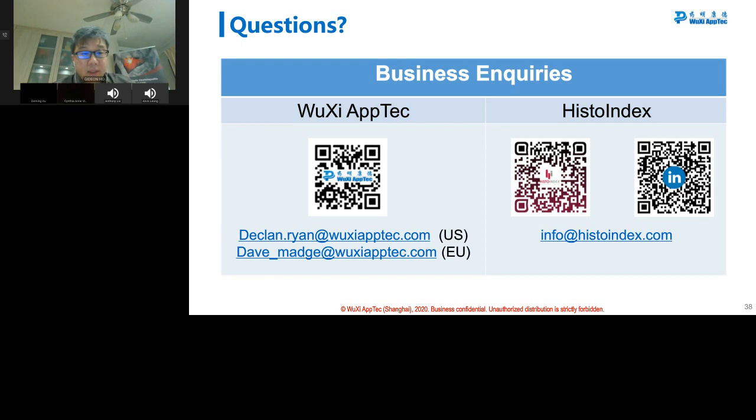Okay, so let me see. I think there's a pretty good question from Bahasini, Ridgeline Therapeutic. How are steatosis and fibrosis continuously monitored using Genesis? Is this via in vivo scanning? It's not in vivo. It is ex vivo, so it is still histology based. When we talk about continuous, it is a continuous way of measuring both fibrosis and steatosis, as compared to the pathologist's way of discretely categorizing them by severity. Normally in fibrosis, pathologists use F0 to F4. That's the NASH CRN pathologist scoring staging method, and steatosis is S0 to S3, so these are 0, 1, 2 and 3. Whereas continuous measurement is basically 1.25 to 2.63. Basically it is continuous. There's no discrete scoring when it comes to that.